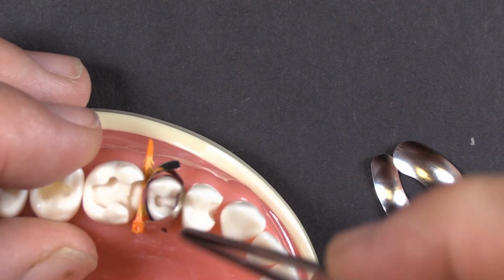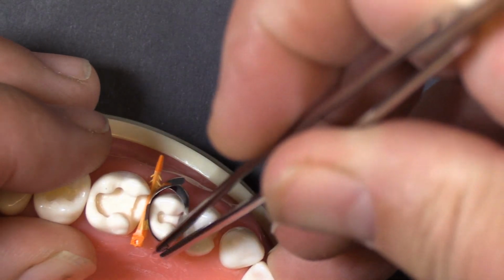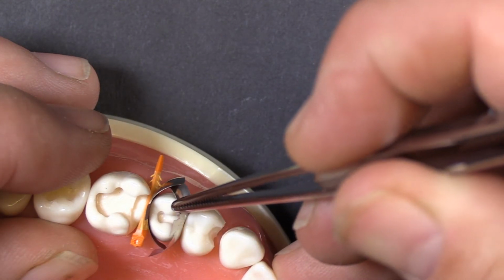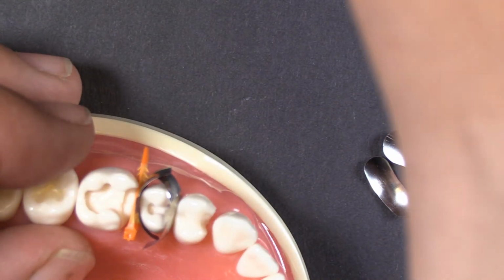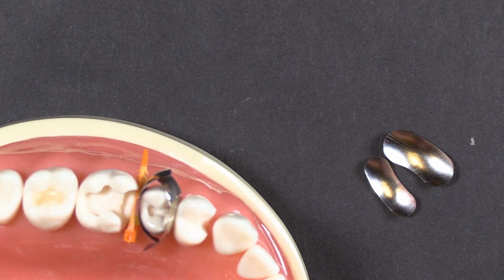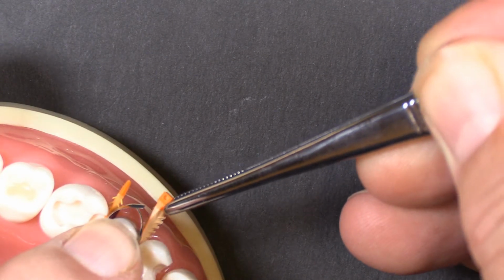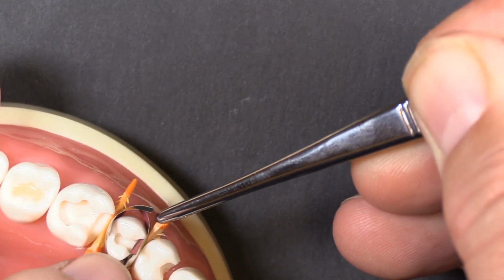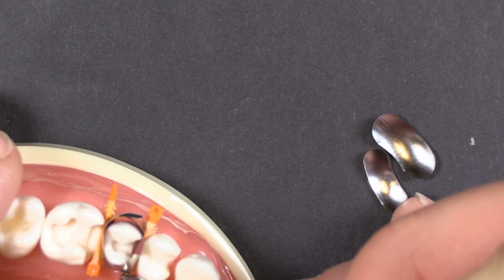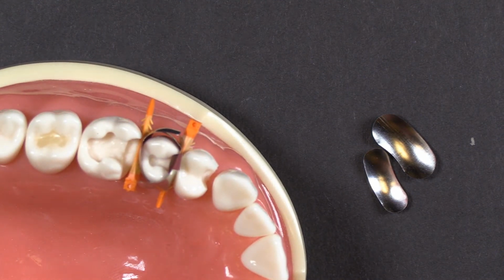So, you know, it's just going to require some extra manipulation to get that band around there. There we go. I'm going to grab another orange wedge. And bring that in from the buccal. Okay, and again, tuck these guys in a little bit before coming in there with the ring. Try to get those out of the way.